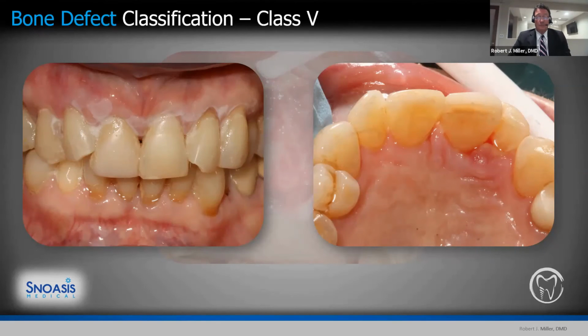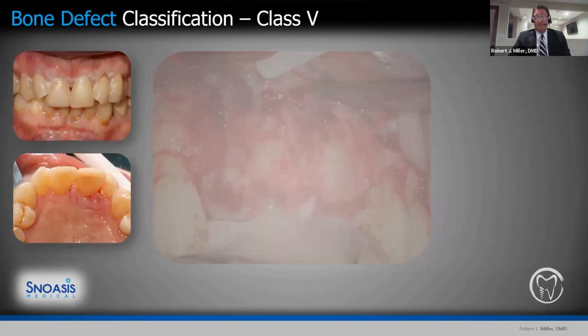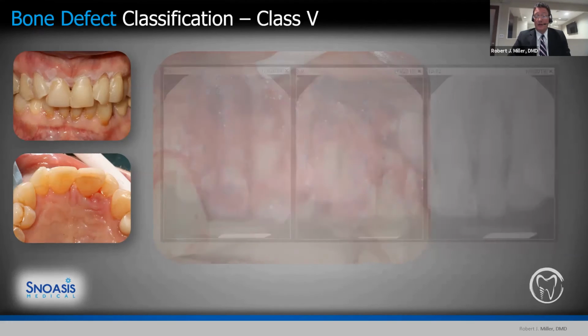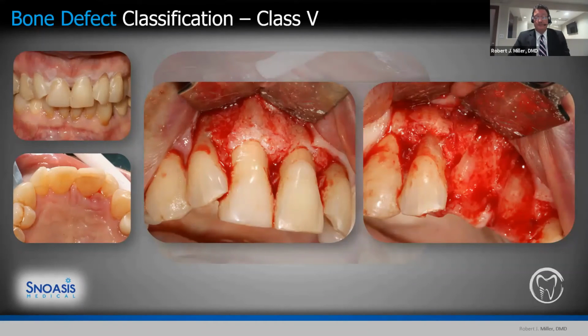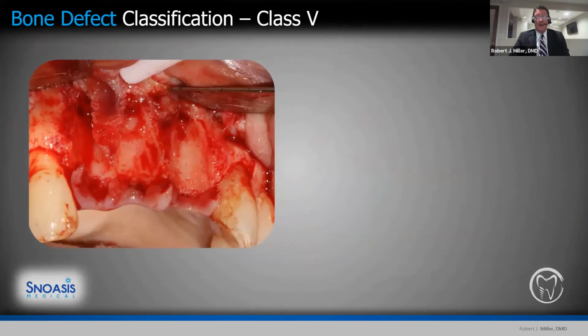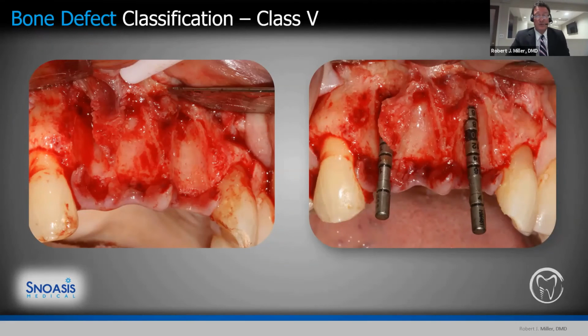So tooth number 8 and 9, we were sure she was going to lose those teeth. And we exposed some periapicals at the time. And you can see the displacement of these teeth and the need for extraction. We decided at this point that we were going to make our final decisions once we had opened up the area. Tooth number 8 and 9 came right out, both the teeth as well as the bone. And then we took a good long look at tooth number 7, and you can see that the buccal plate was broken at this point as well. So it was decided at the time that we would remove tooth number 7. And the treatment plan would be to hopefully place implants in position number 7 and 9 and fabricate a fixed implant bridge.